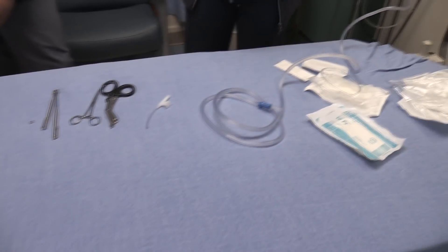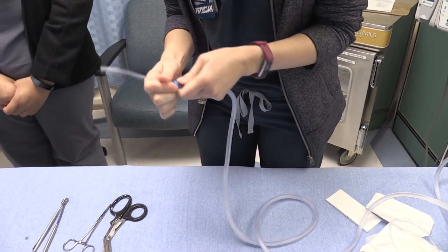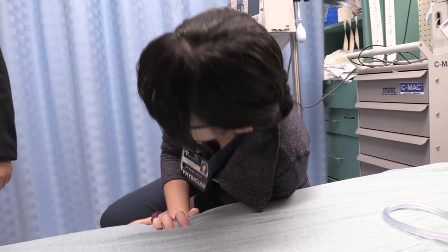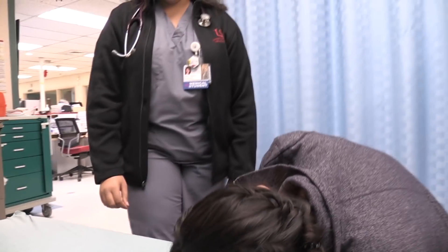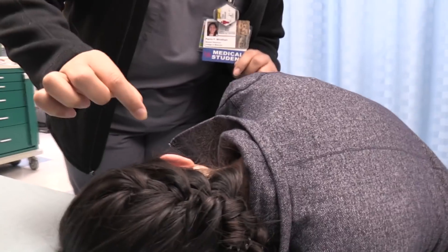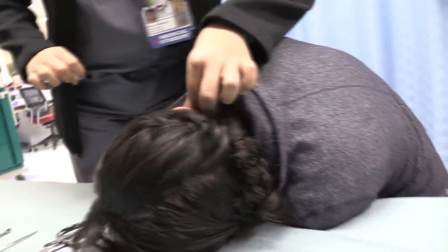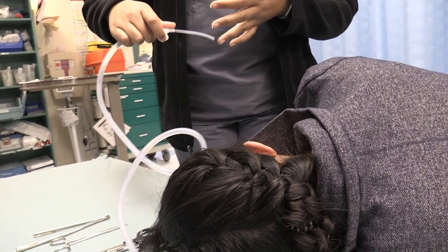Go ahead and hook up the suction catheter there, and pull that out. Get comfortable — if you need to take the glasses off you can do that too. Perrin, go ahead and drop the hearing aid battery in the ear. Okay, it's in there. So here's your suction — and we can go to 18 French if we have to, but let's see if this works.